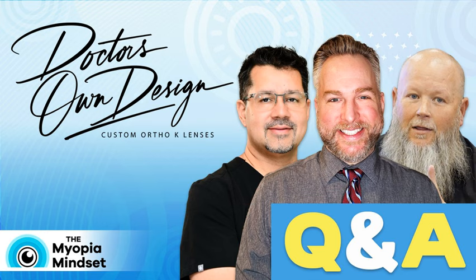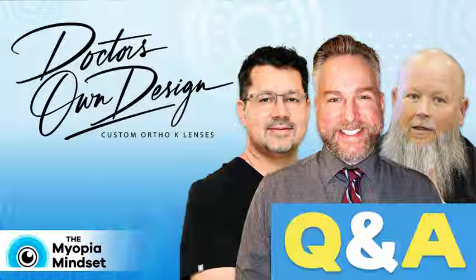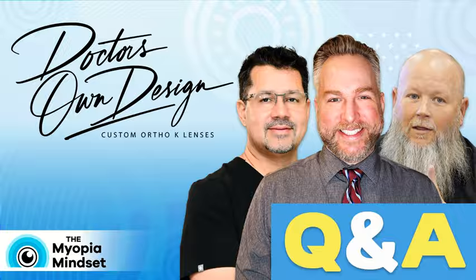The problem I had is I had to spend a lot of time on the phone with Mark to design a lens. I want to design this lens for this patient. Here's the information I got, but I want to change the optic zone because the patient has a smaller pupil size, or I don't want to go with the standard diameter. I want to change that.